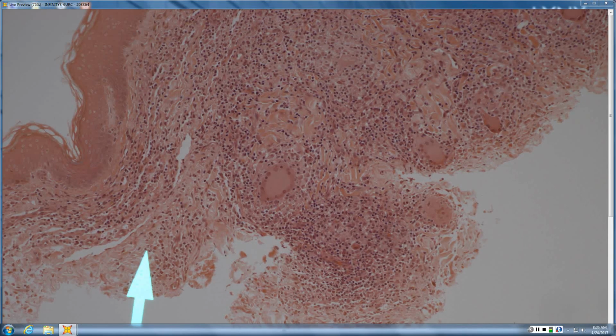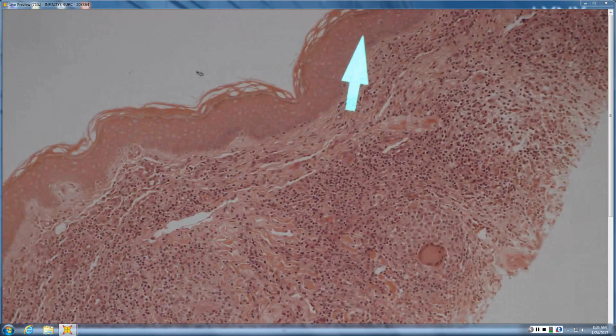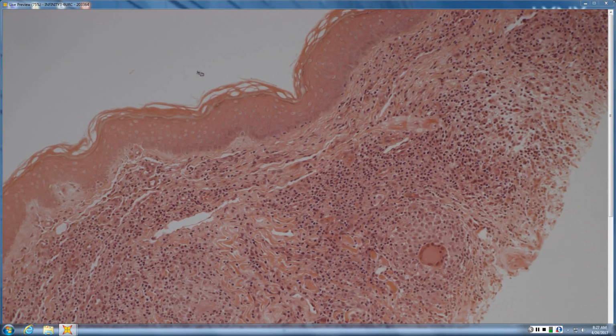So granulomatous slack skin or granulomatous MF would be two things. So you'd look for evidence of epidermotropism. There are a few cells with basilar tagging, and it may not matter that much, because granulomatous slack skin, the majority of them go on to MF. And it's a clinical differential. If they've got big saggy areas of skin with this histology, then they've got granulomatous slack skin. Some go on to Hodgkin's, most go on to MF.